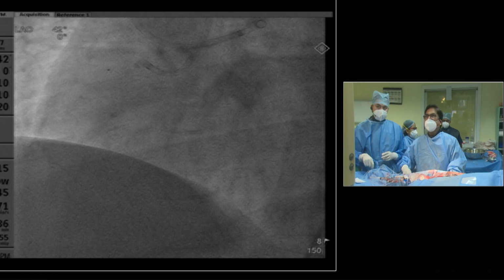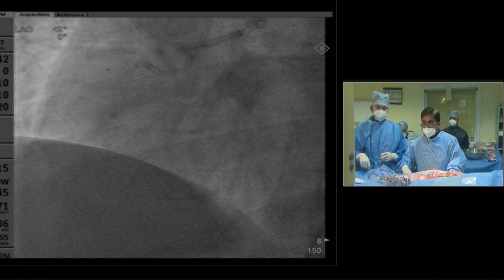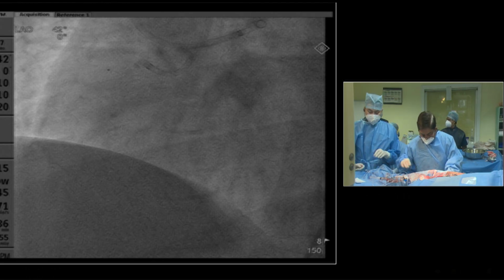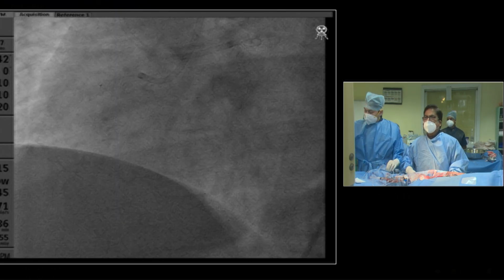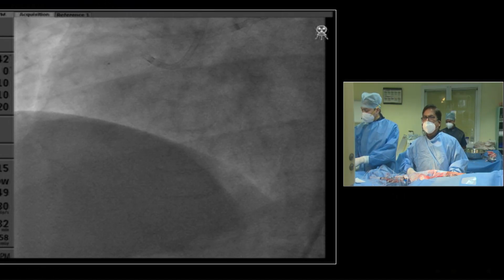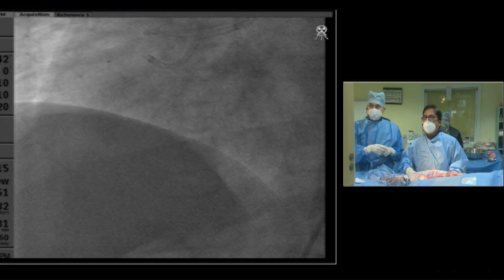The other thing I can do is, if this branch is creating a problem, I can occlude this branch with a balloon. There is the anchor balloon technique. It does work, but we have to take only a 2 millimeter balloon at maximum. You can take 1.5 or 2, because the vessel is not that big as an anchor vessel side branch.